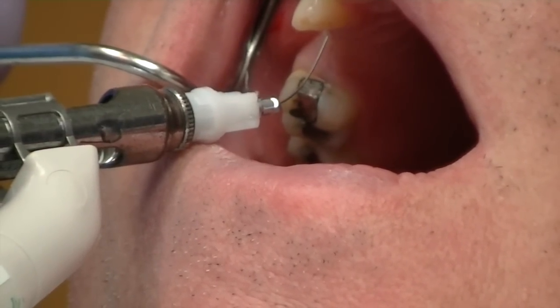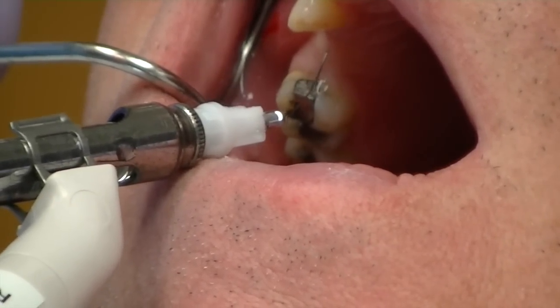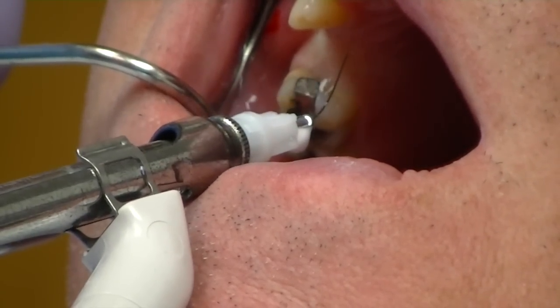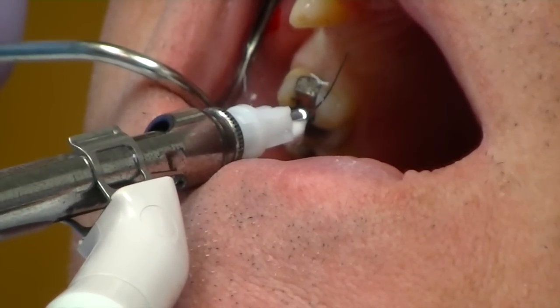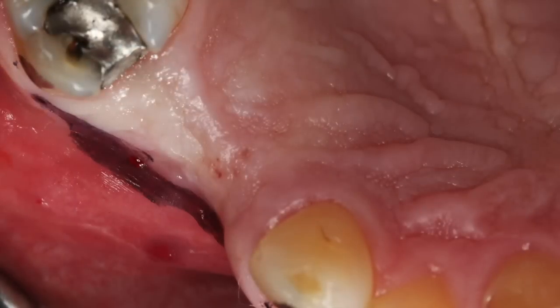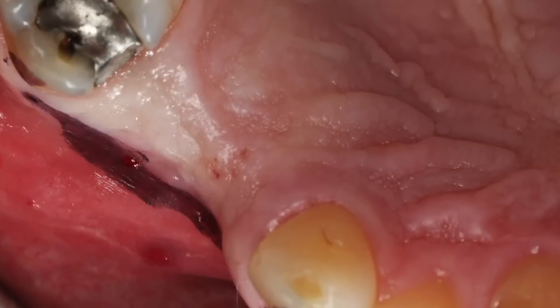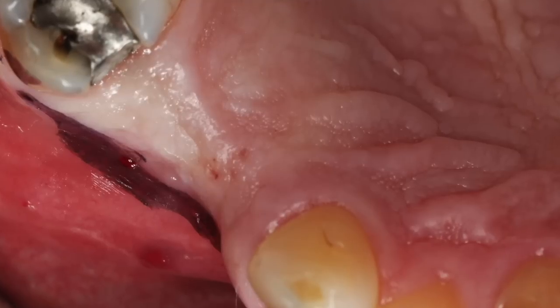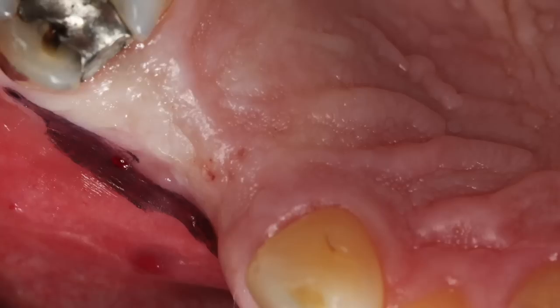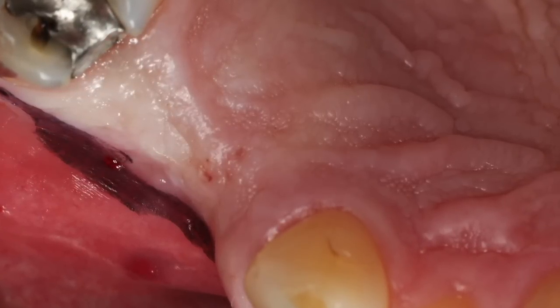Basically a pain-free injection in our surgical site. You can see here that I'm infiltrating — I'm not really blocking the entire area. I infiltrated into the vestibule and I'm walking up the edentulous space onto the palatal surface. I'm a big believer in getting intense anesthesia of the soft tissue. Remember, bone is not innervated — bone has no pain receptors in it. Nerves run through bone, but not in this area. So we just want complete anesthesia of the soft tissue.